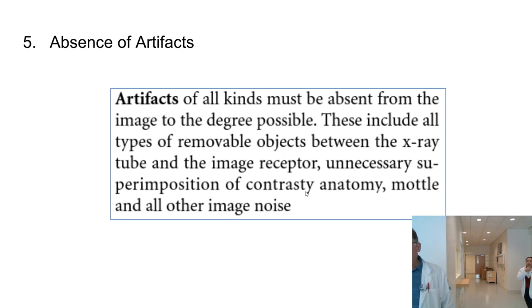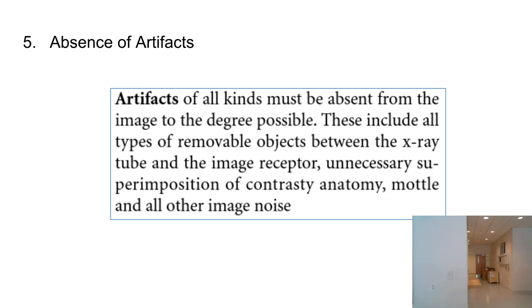Professor, we're done with this. Oh, you're done. Okay. Hold on, let's see. Ah, see, it's much bigger. So same thing happens here. Can you guys see this? So what's that one? This is no collimation. Looks pretty small. When you collimate, it looks much bigger. Okay. So whether you're using CR or DR, the rule is collimate to the size of the part, without cutting anything.